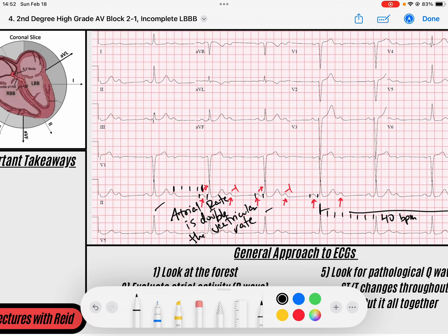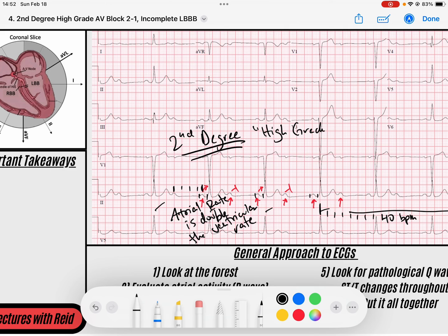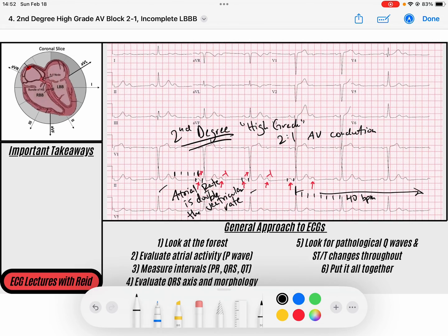So what do we have here? A second degree block — because some but not all P waves conduct to the QRS — specifically a high grade block with 2 to 1 AV conduction. I hope this helps you understand the differences between type 1, type 2, and high grade second degree blocks. It's important because we cannot call this a type 2 second degree block. If you have questions, put them in the comments, and we'll see you on the next ECG video. Take care!